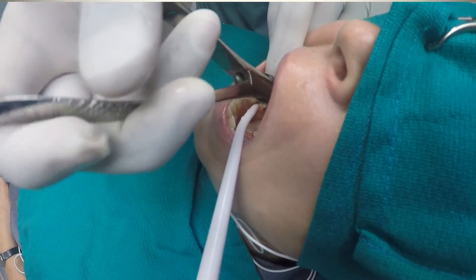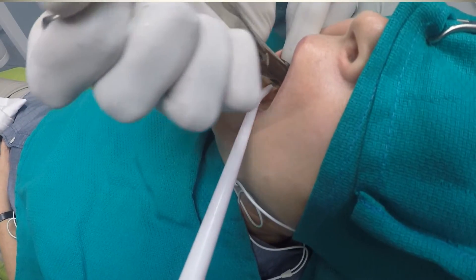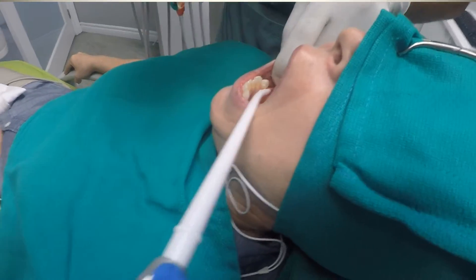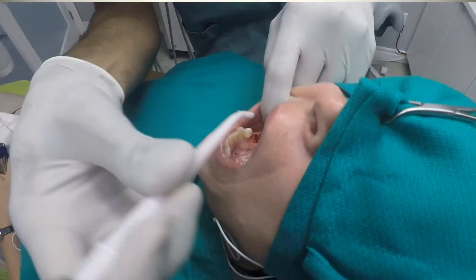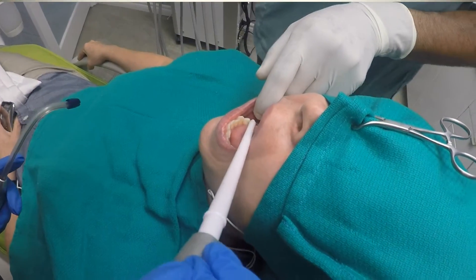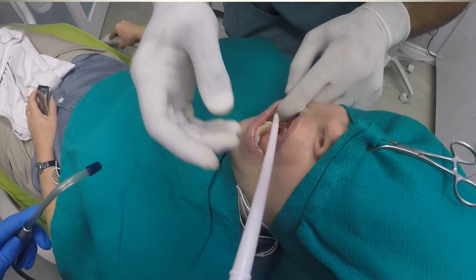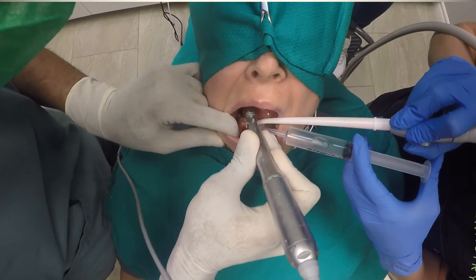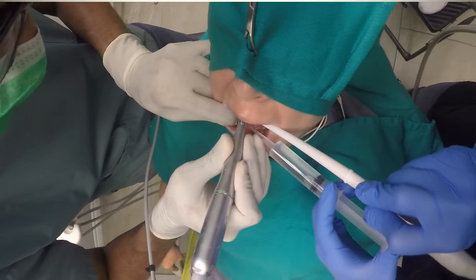One word of advice: if you are going to use this particular procedure, you probably want to use single-patient-use drills rather than sterilized drills reused on multiple cases. The main reason is that whenever you're drilling tooth — both enamel and dentin — it is far more mineralized and harder than bone. As a result, your drills will go dull fairly quickly, so it would be beneficial to use a single-patient drill.